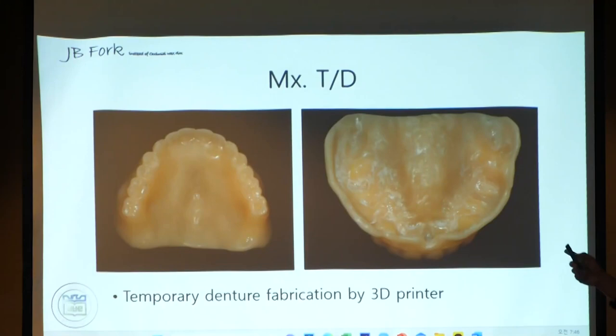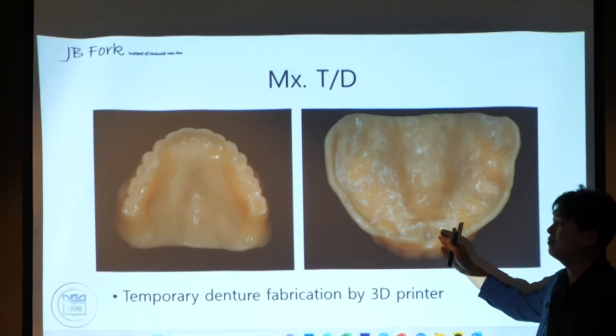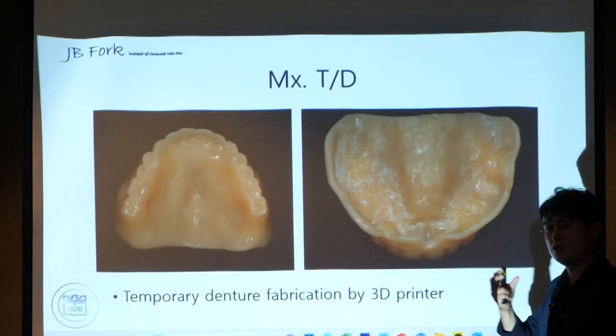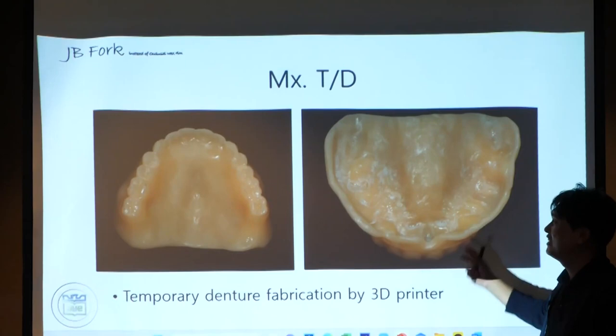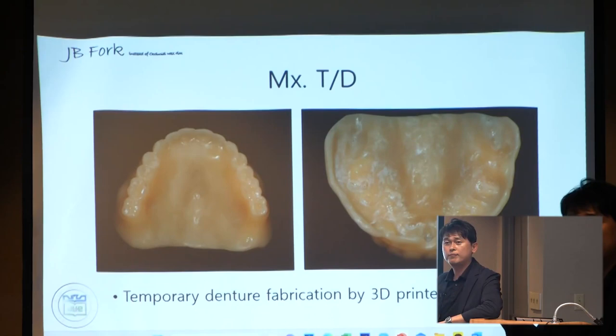In Korea, we cannot make the final denture using 3D printing. It's illegal until now. So we have to use this 3D printed denture only as a temporary. But when I deliver this temporary denture, I can see enough retention. I cannot pull out this denture by my power. So it's strange. With an intraoral scanner, the more experience in intraoral scanning makes well-fitting dentures. Yeah, so there is no overextension.